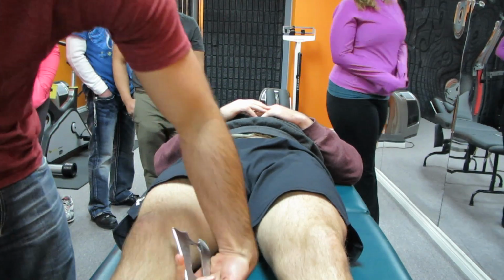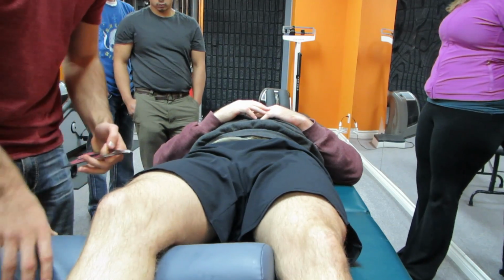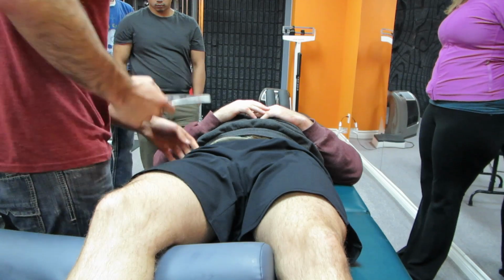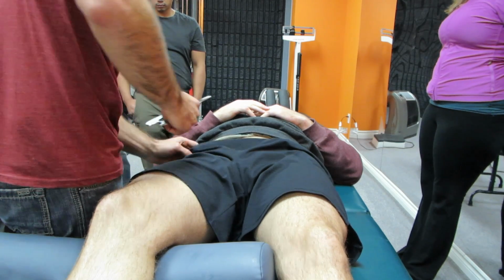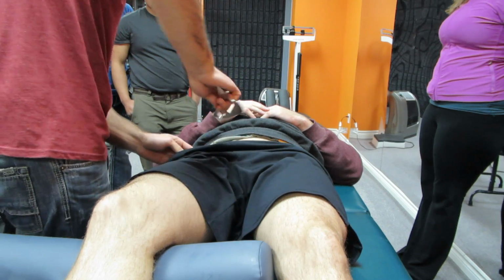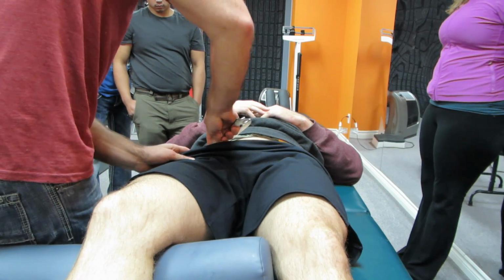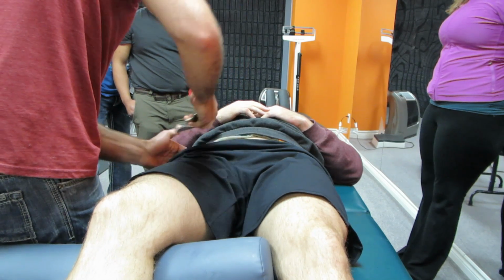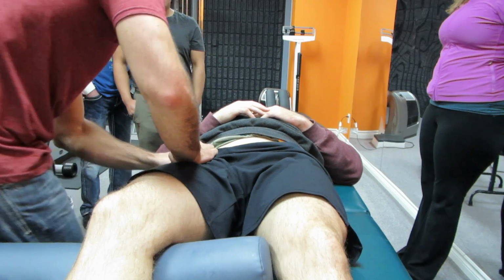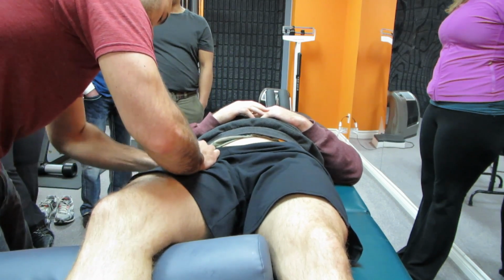Okay, and if we want to get into the hip flexors, I'd probably get something a little bit bigger than that, but that's still going to support it enough. And we can get in through over those guys there. And this one's going to be easier for me to attack with my left hand, so that's what we'll do. I'll get in through those tissues in there, okay?